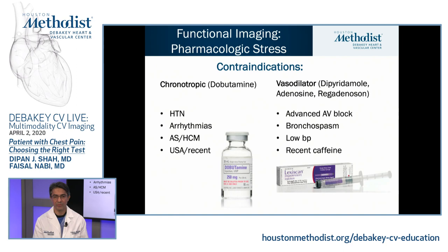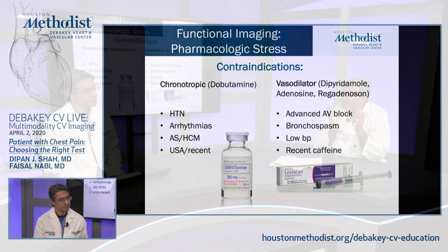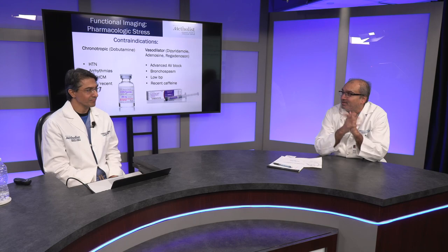Just let me ask you there, though. In the real world, a patient shows up for their vasodilator stress test and says, I had a small cup of coffee at 5 o'clock in the morning. What are you going to do? And they drove 2 hours to come to your lab.